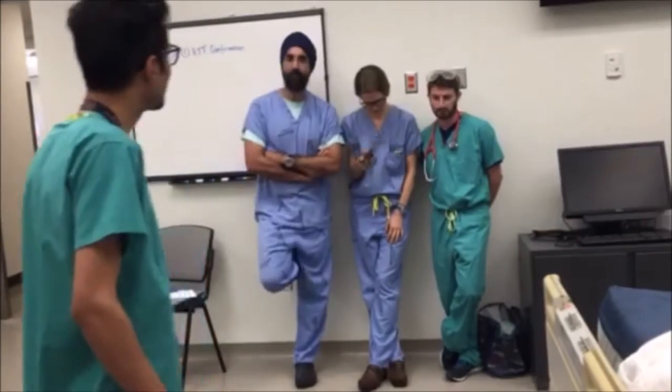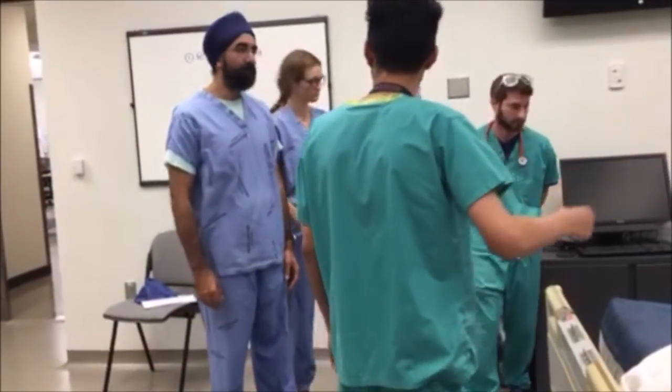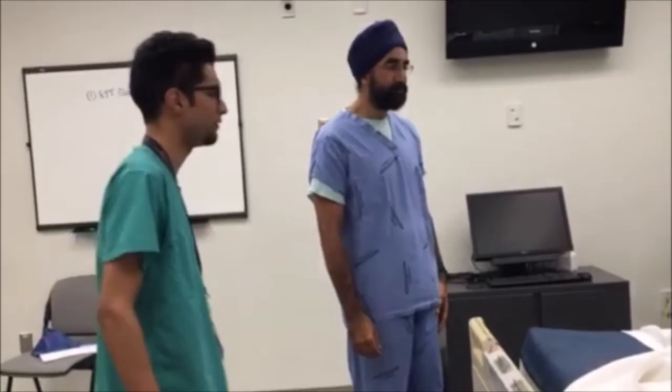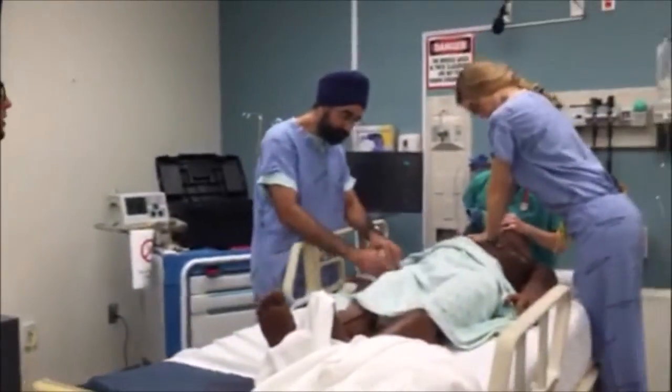Okay, team. So we're going to get a cardiac arrest patient. Dr. Calrissian, I'm going to need you to take care of airway. And Dr. Gunnan, I'm going to need you to give good quality chest compressions. And Nurse Coley, you're going to be taking care of IV drugs. Sure. Okay. All right. So Dr. Calrissian, what's the airway status?